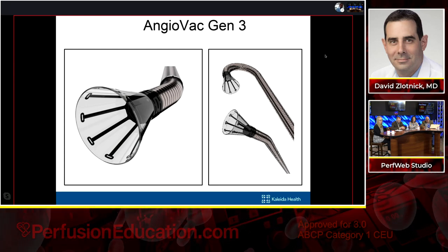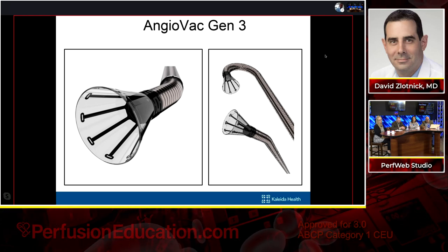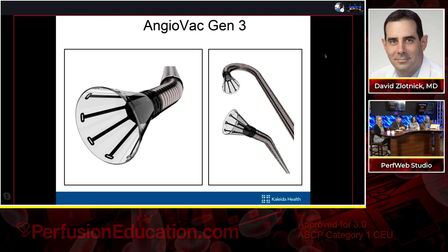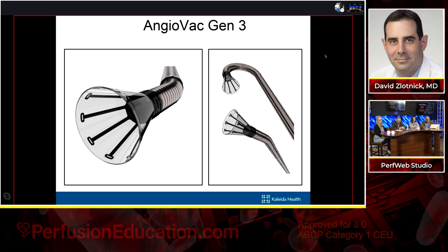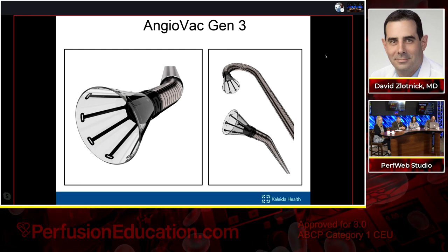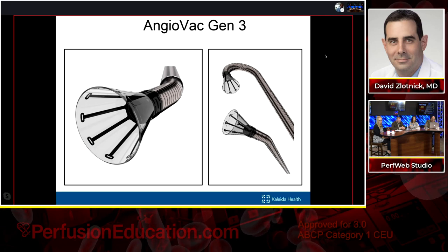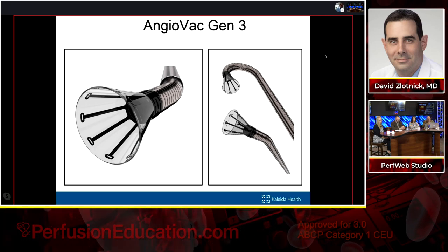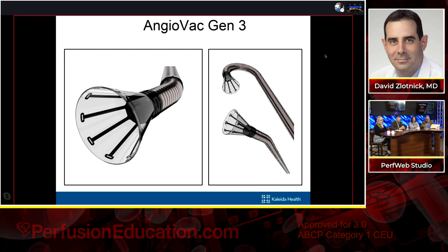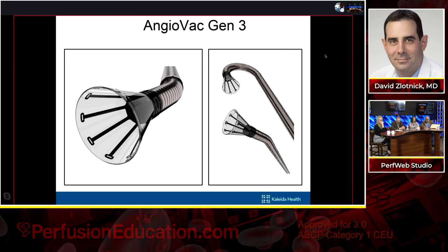It's really made the procedure easier and faster. As it comes out through the sheath, we can actually control the amount of bend that the cannula makes, anywhere from around 60 all the way to 180 degrees. Unfortunately, I think this next slide is going to have both video images as well as still frame fluoroscopic images of the C180 cannula. This was a tricuspid endocarditis case that we recently did in this patient.